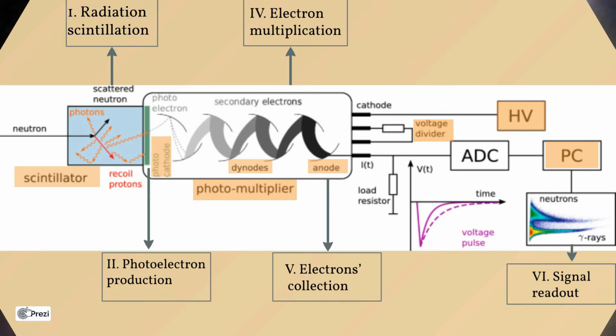However, the more convenient and generally used method is to convert this current into voltage and then amplify this voltage to achieve a good signal to noise ratio. The current to voltage conversion requires the addition of a load resistance to the circuit. And that's how the dose is detected in scintillation dosimeters.